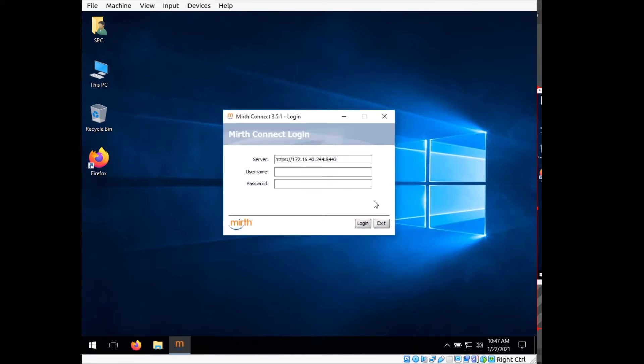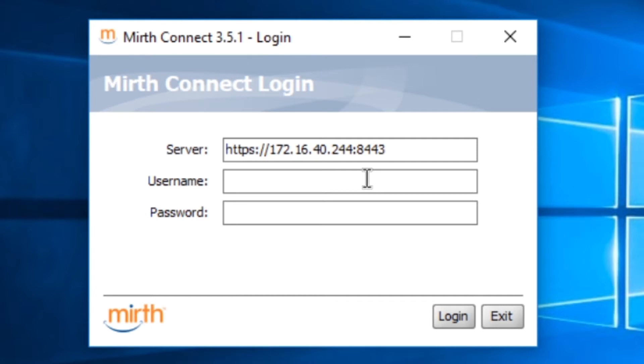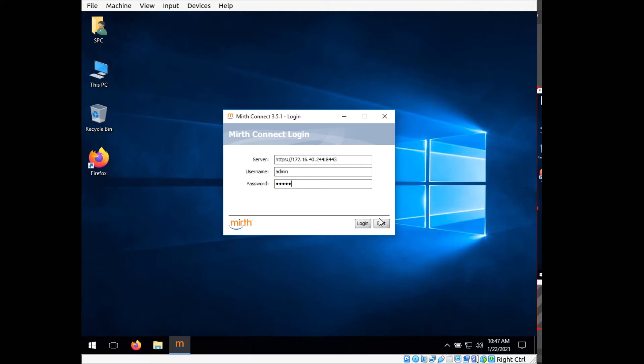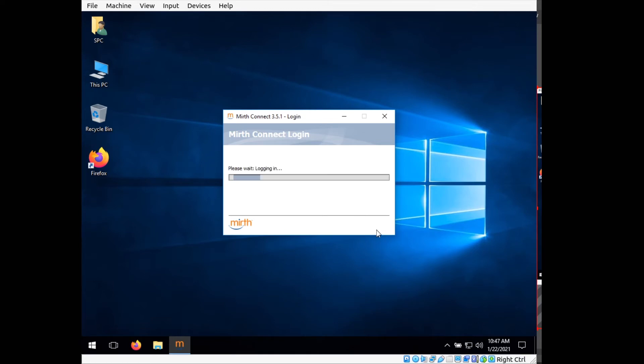So now we have the interface to our Mirth Connect server. What I'm going to do is type in admin as the username and admin as the password, which is the default for Mirth Connect. Click login.